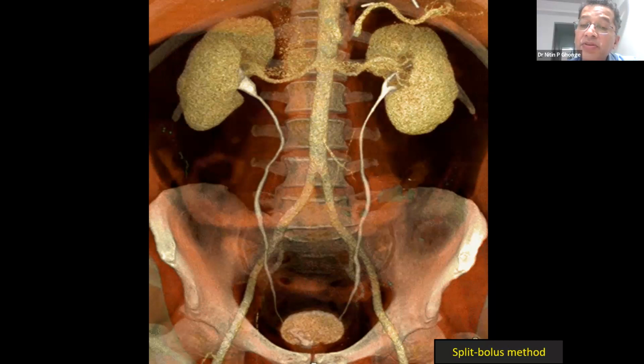But if you are concerned about the vascular structures also, this particular method helps to minimize the number of scan acquisitions for a particular scan. Like for many studies, if it is not required, we try to abolish the plain scan also. So depending on the clinical indication, we can reduce the number of acquisitions so as to reduce the number of phases, and that will reduce the amount of radiation. That is one important drawback with CT because of the radiation, which is not there with MRI.